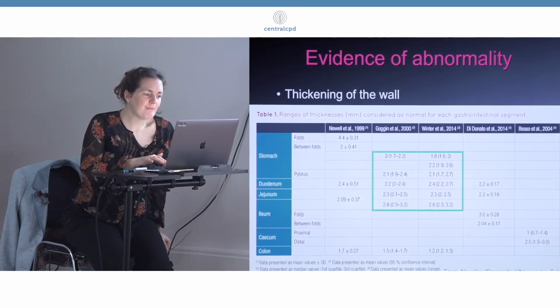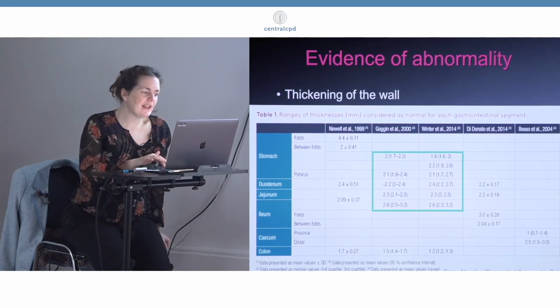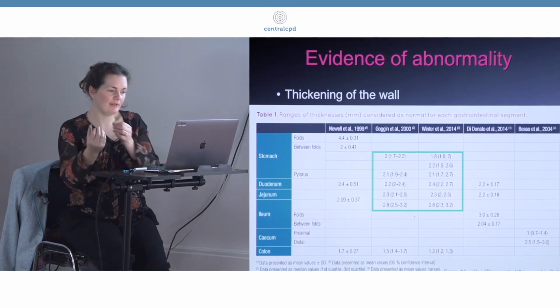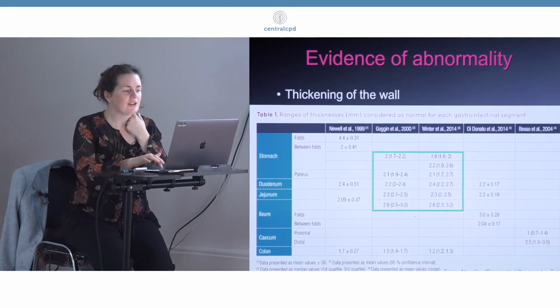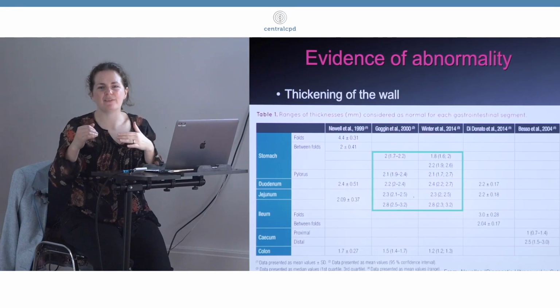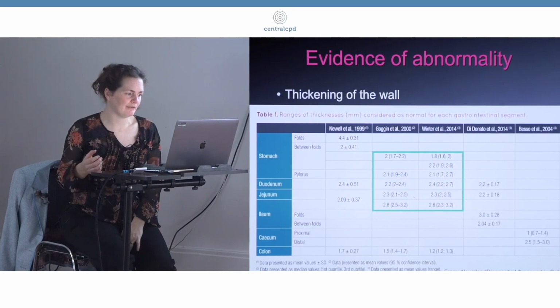And it shows that mostly the bowel is around about 2 millimeters for the stomach, and you'll notice that the ranges aren't that far off. So 2 millimeters or a tiny bit above for the stomach, and then the duodenum, jejunum are again just slightly over 2 millimeters. But you might find that when you get to the ileum, particularly when you're finding the folds, if you measure at the level of the fold, it's just very slightly thicker again. So the general rule of thumb is for the majority of the small intestine, you wouldn't expect it to be above 2.5 millimeters. And then for the ileum, you just allow a little bit extra, because it is that slightly unusual piece of bowel. It looks a bit different.